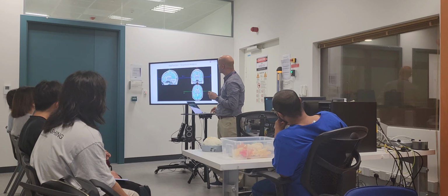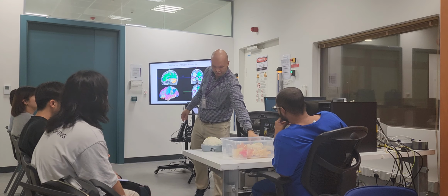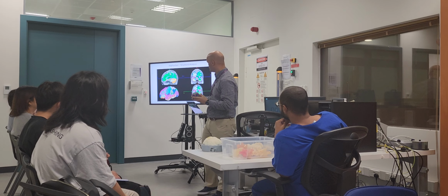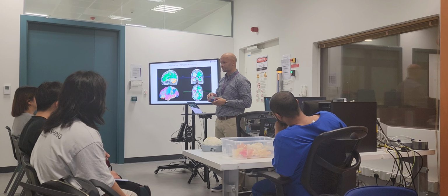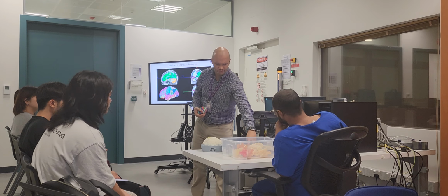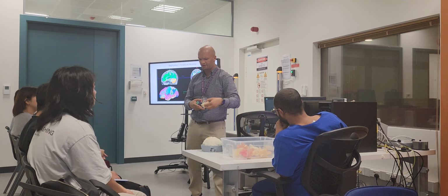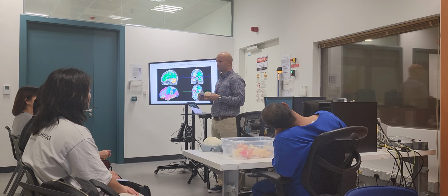Okay, what we do is we give this to a supercomputer and we do what we call brain segmentation. And this is printed here at NYU, similar to that. So quick anatomy, it's cortex. The brain has frontal lobes, parietal lobes, temporal lobes, and occipital lobes. Okay, you can look at cingulate as well inside. Okay, you can talk about the brain from its lateral view, from its medial view.